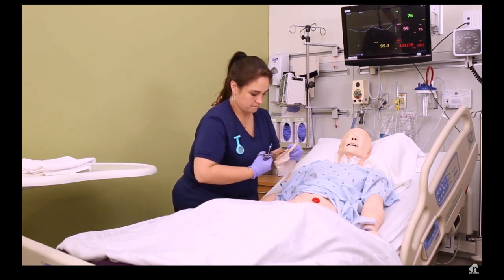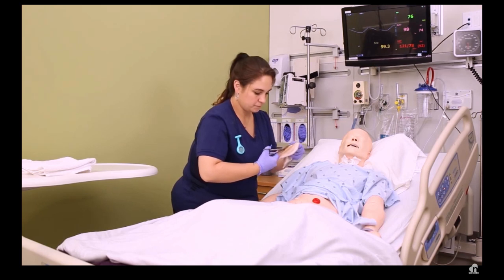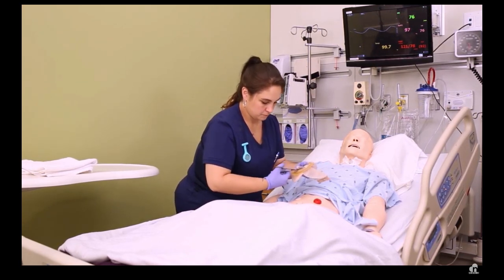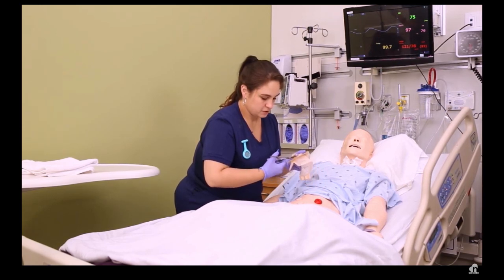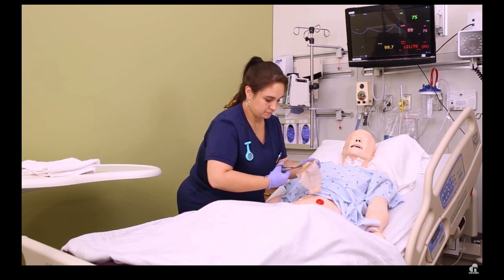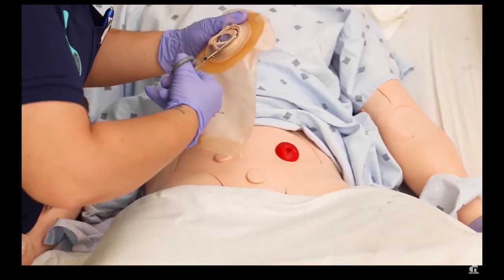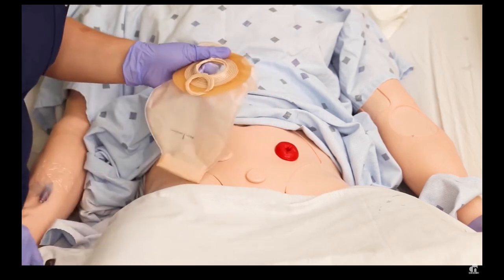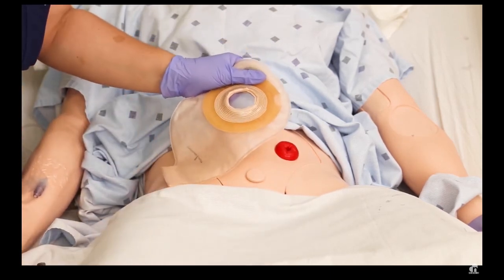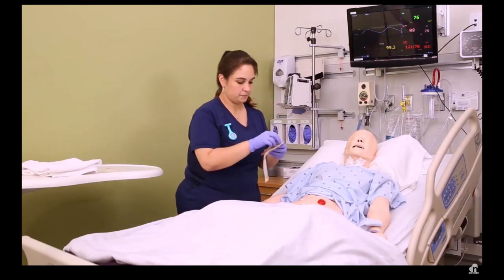So now you want to measure the stoma and cut the hole of the wafer to be about 1/8 of an inch larger than the stoma. If it's too small, it can actually cut off circulation to the stoma itself. So you're going to use a pair of scissors to cut around the inside hole of the wafer. Now, some wafers, depending on the brand you have, some of them have little measurement tools, some of them don't. So just make sure that you are about 1/8 of an inch larger than the stoma itself.